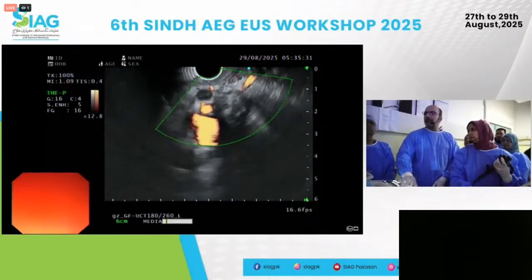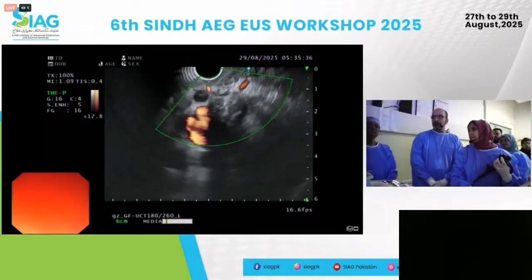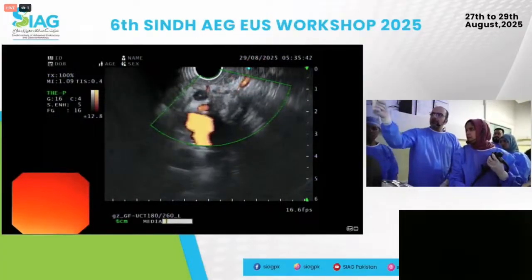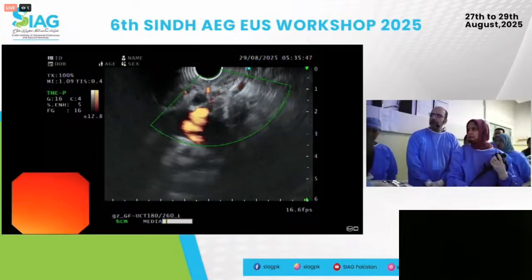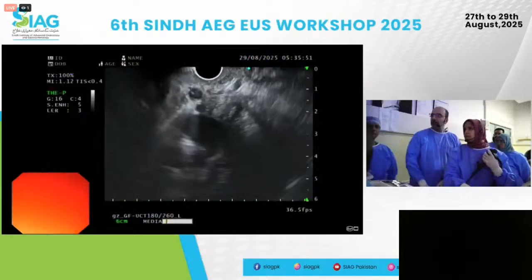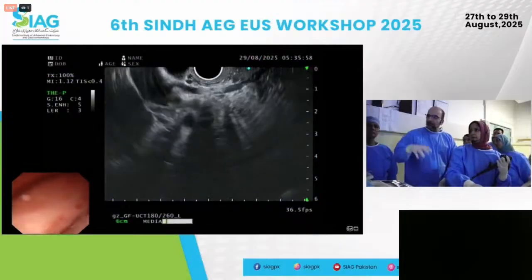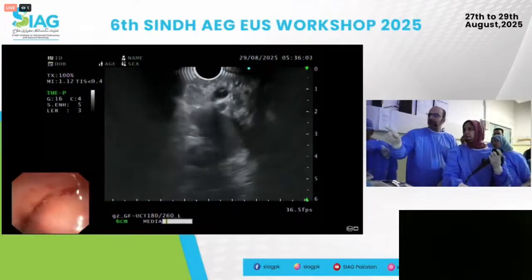So what do you think? What's usually between the bulb and the portal vein with no flow? PD. Basically, CBD is expected to come from above. Why don't we go counterclockwise here? Try and maintain that view. I'm going to turn this off. Push the scope forward. Relax your big wheel away from you. Good. And keep going counterclockwise. So that's probably CBD coming from above.